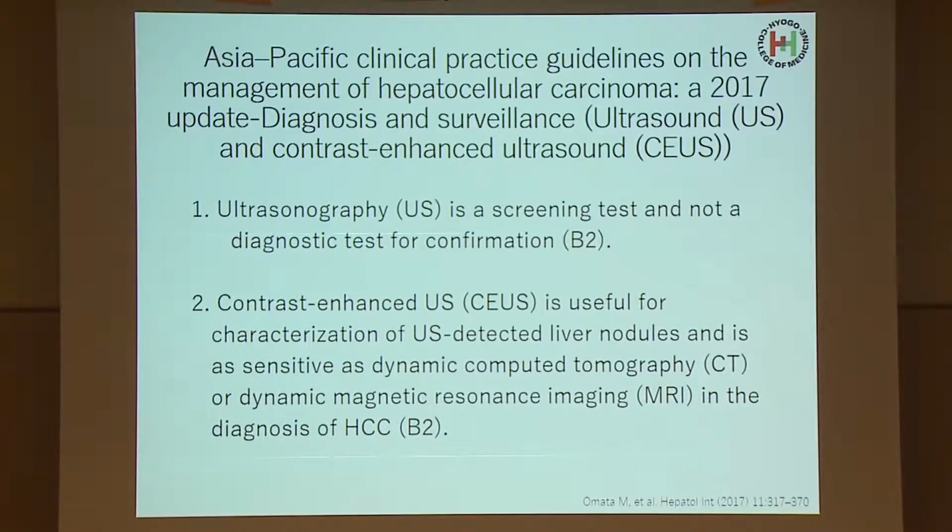The role of ultrasonography in the APASL HCC guideline is presented as follows. First, ultrasonography is a screening test and not a diagnostic test for confirmation. Second, contrast-enhanced US is useful for characterization of US-detected liver nodules and is as sensitive as dynamic CT or dynamic MRI in the diagnosis of HCCs.